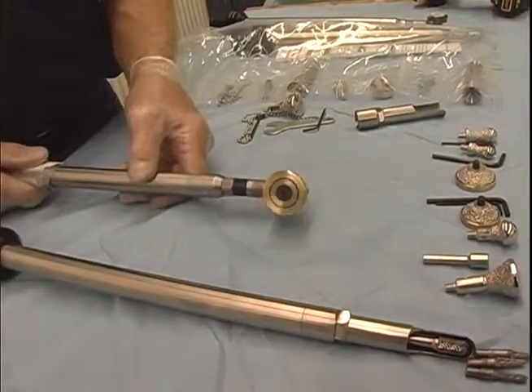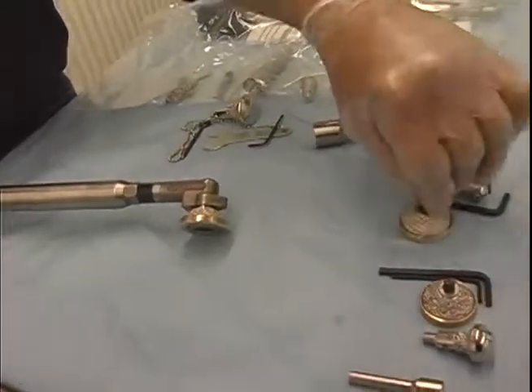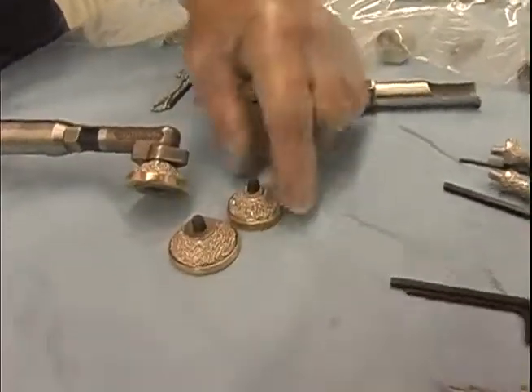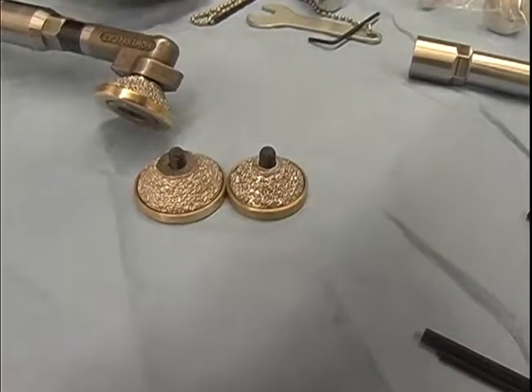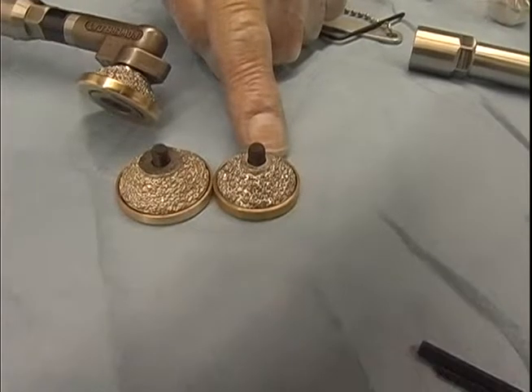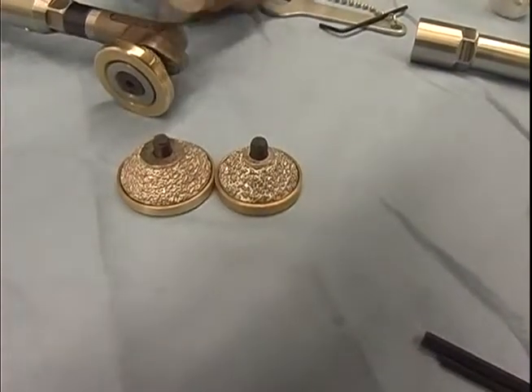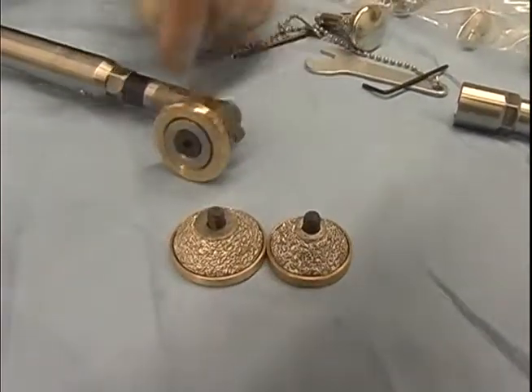This is the chamfer burr for large horses. You can see that this is the same one. The large chamfer burr is too big for miniature horses. So if you wish to use a chamfer burr on minis, we have to go to this smaller size. So this burr fits on this right angle just like this, but it's small enough that you can get into the back of the mouth of a miniature horse.